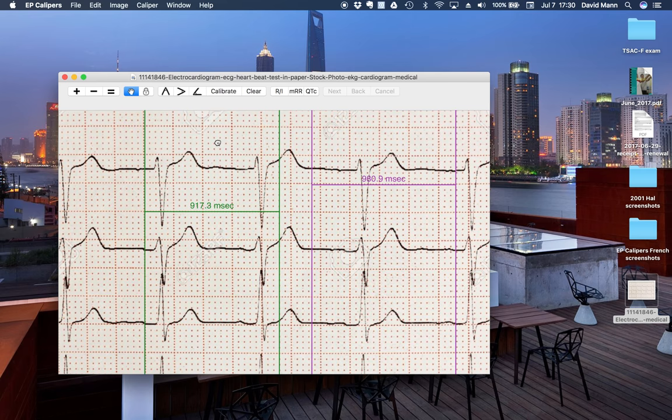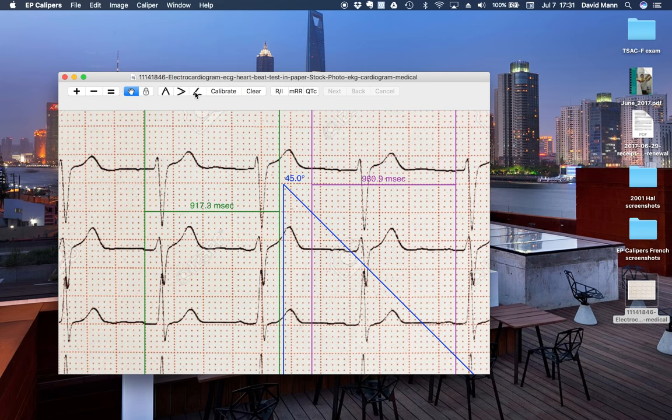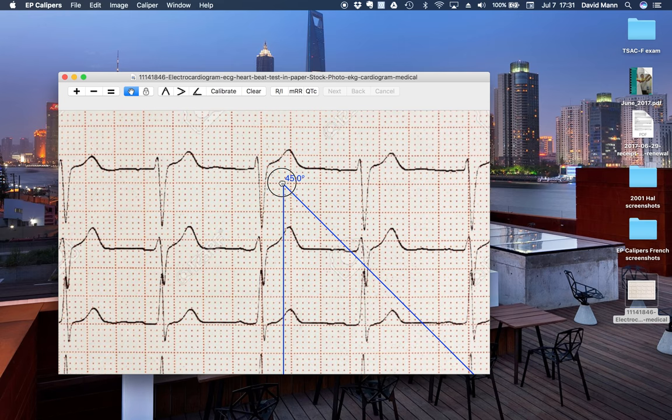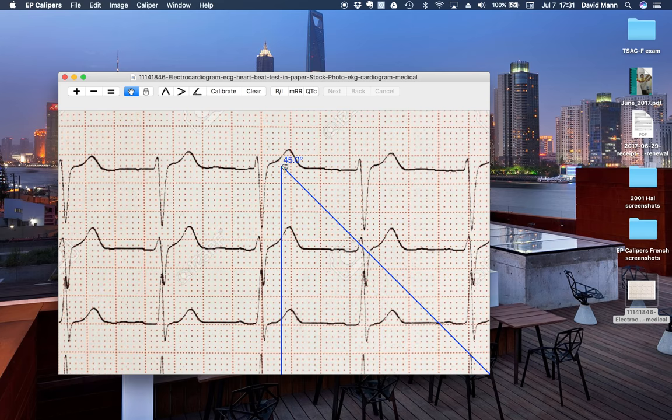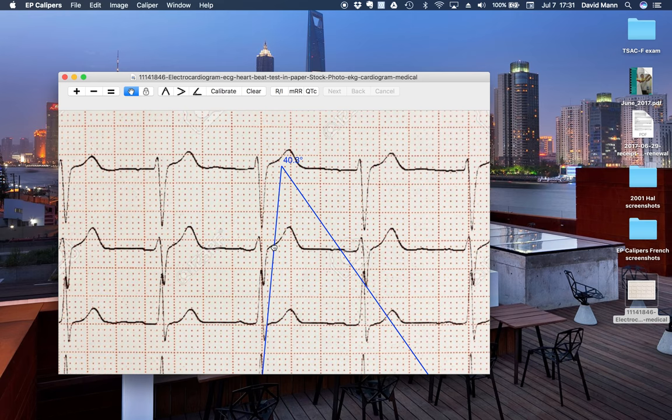And another thing is you can use your angle calipers to make, obviously, angle measurements. But there's something called a Brugada meter, which you can use to assess the presence or absence of Brugada syndrome. You can measure what's called the beta angle.